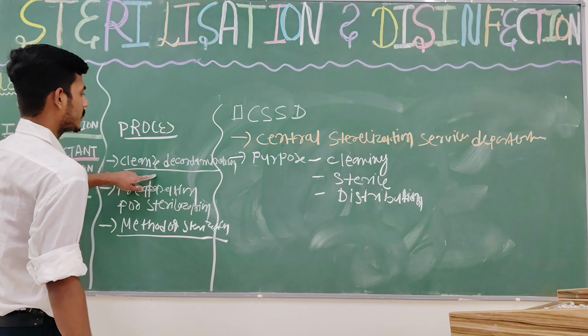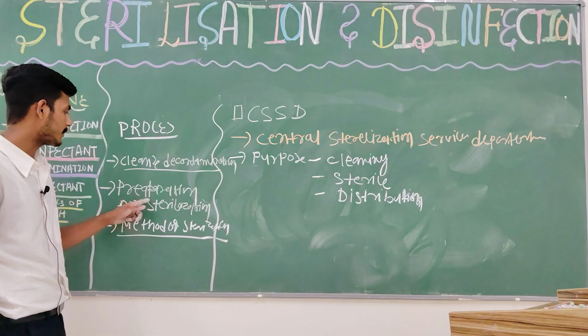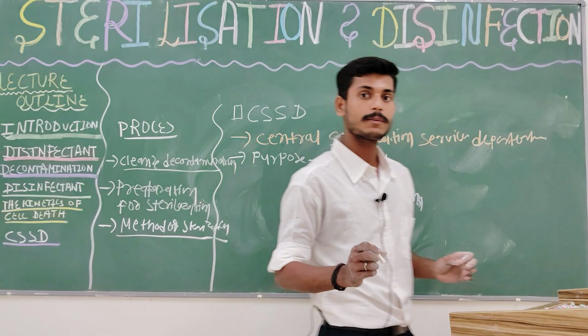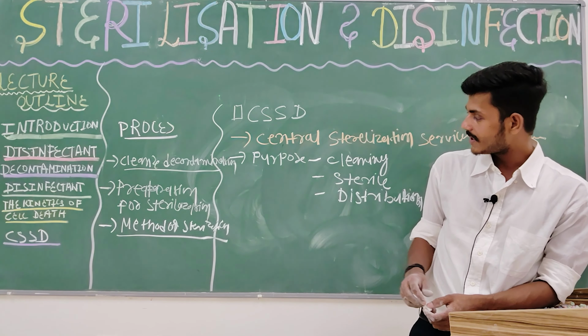So the first step is cleaning and decontamination, the next is preparation for sterilization, and the third is choosing the suitable method of sterilization.